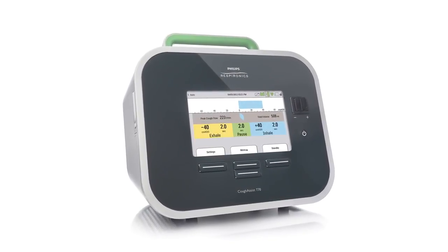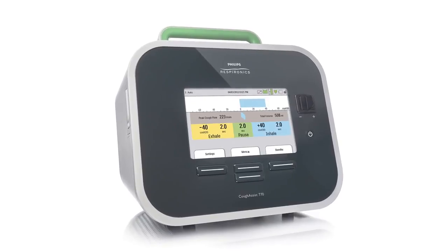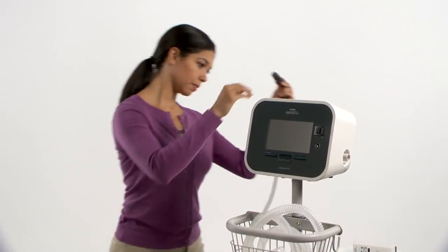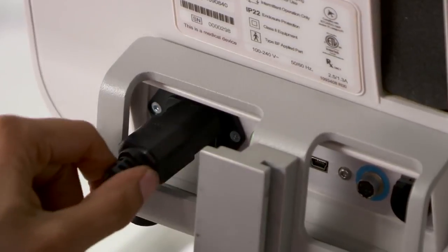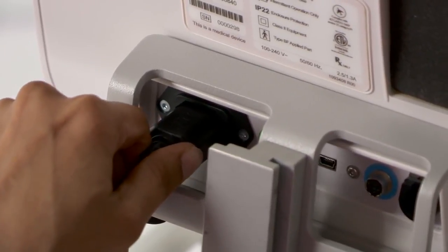CoughAssist T70 is designed to be easy to set up and operate. To power the device, press the power cord firmly into the back of the device and plug the other end into an AC outlet.